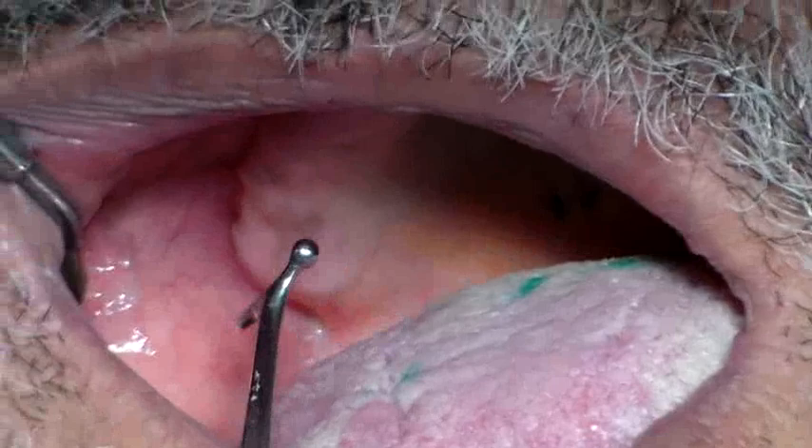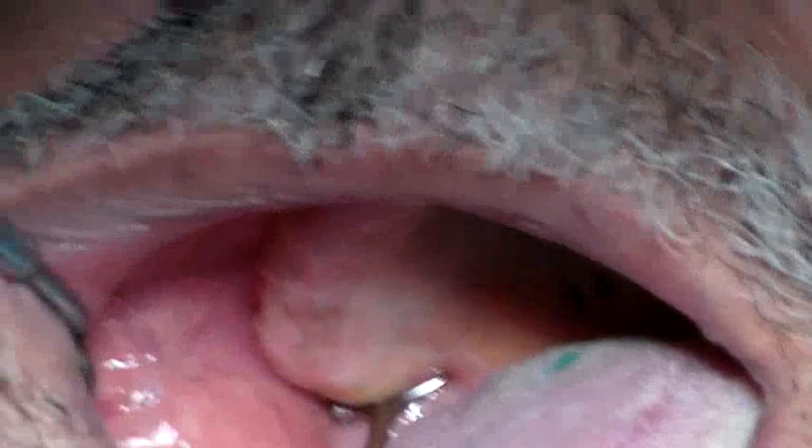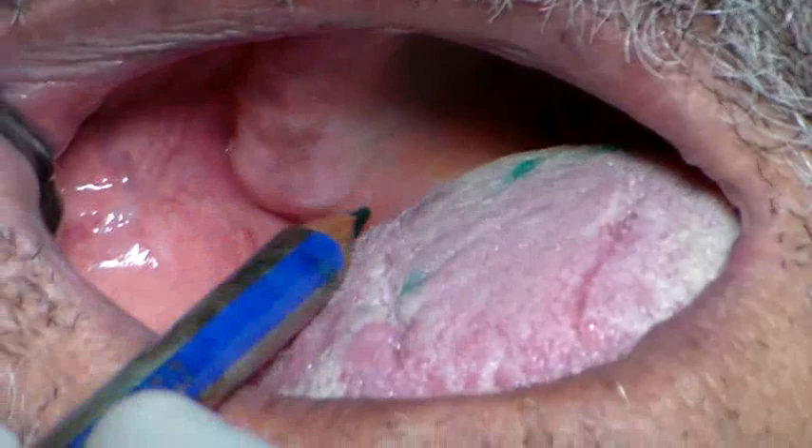You mark the hamular notch on the other side as well. Again, the ball end towards the cheek — come along the ridge and then it falls in. This is the hamular notch, so you want to mark it.